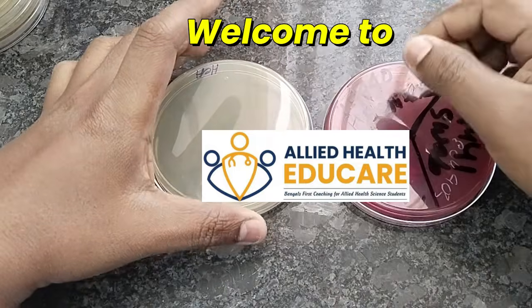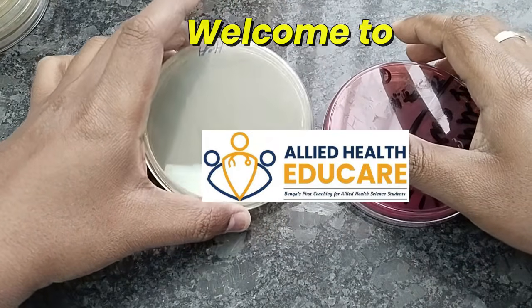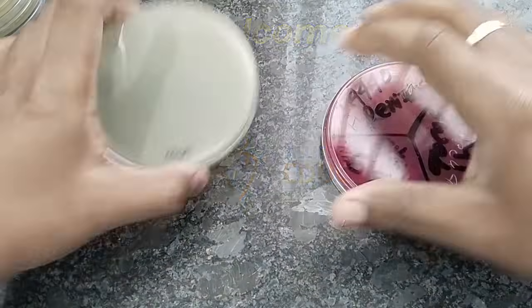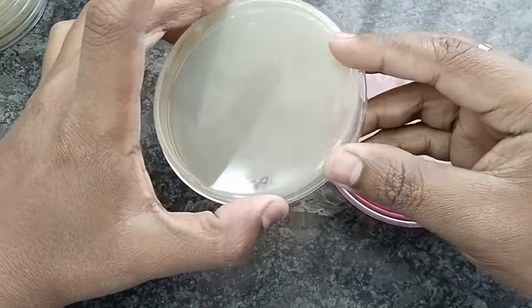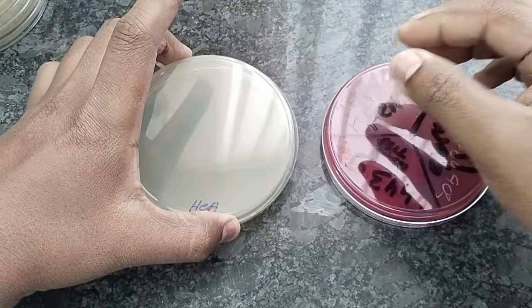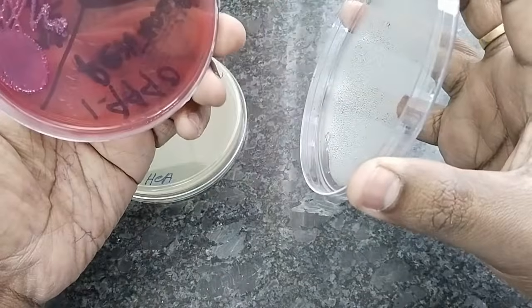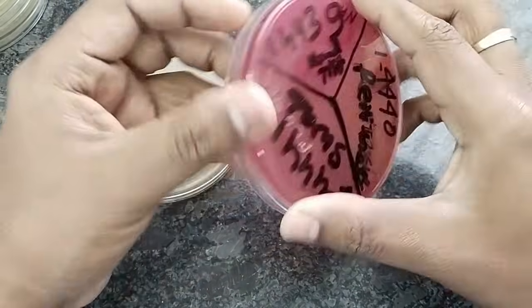So today we are going to discuss a special media, that is HiChrome Agar. Nowadays we are using HiChrome Agar for the determination of bacteria that can cause UTI. Previously we have used this type of media, that is MacConkey Agar.